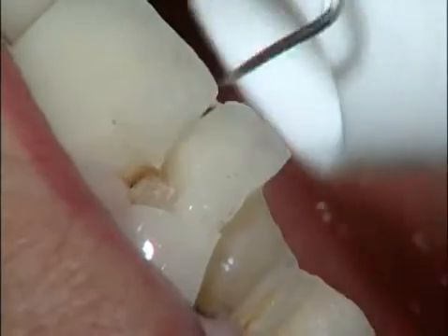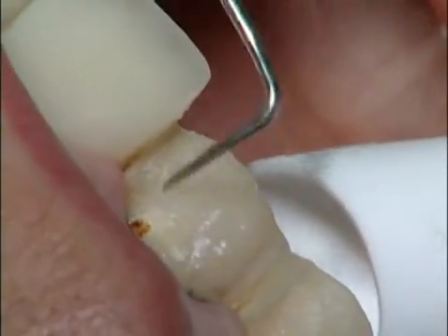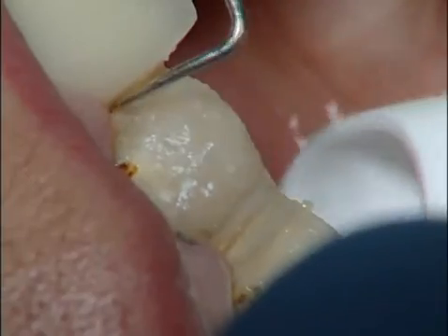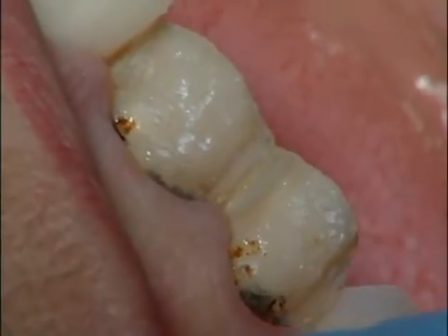So in just a short period of time, we've removed the old veneers without causing more trauma to the teeth. I was able to clean up the teeth without anesthetic, make new temporaries. A week later, when the patient came back, she was thrilled with the results of the new veneers.